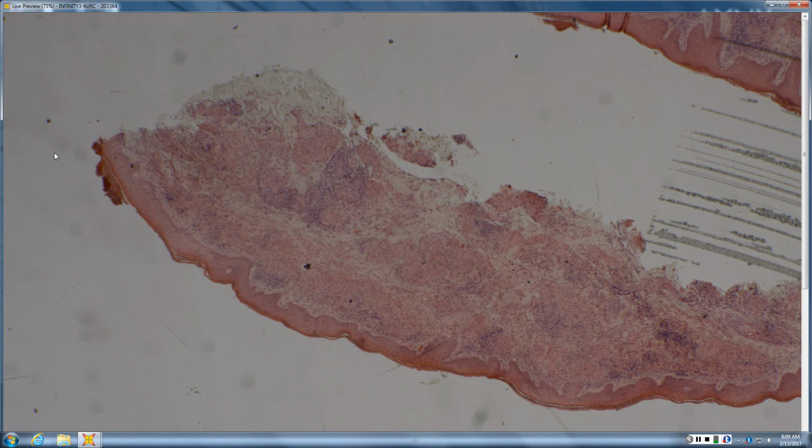And then for the granulomas that have lymphocytes. So, I mean, like a rheumatoid nodule, or like granulomatous. I don't particularly see a palisaded granuloma with fibrin, like a rheumatoid nodule, but granulomas with lots of lymphs around.